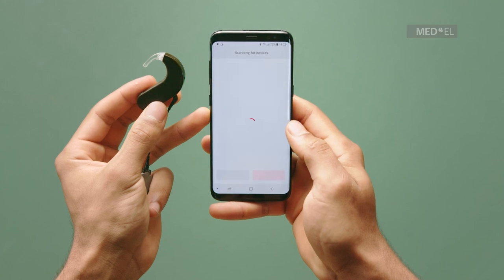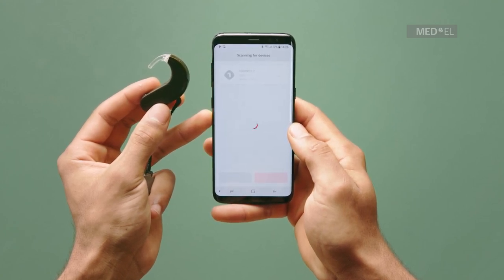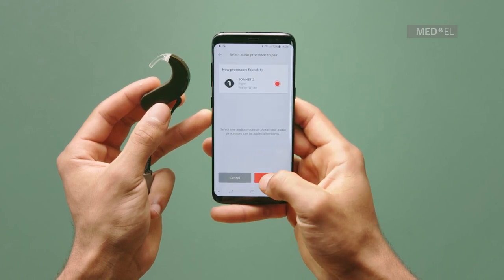Select your option, then tap Next. AudioKey will automatically pair with your device. Once your audio processor is paired, tap Next.